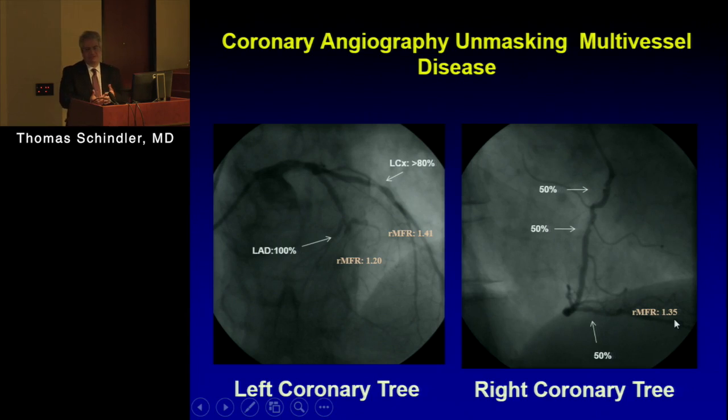So in this patient, initially, the patient was planned for reopening interventionally of the LAD lesion. But when we discussed it in the common board meeting and we could show, okay, the lesions in the LCX and RCA cause also flow limitation, patient was sent for CABG. So this is a nice example to show how flow quantification can give incremental diagnostic value.